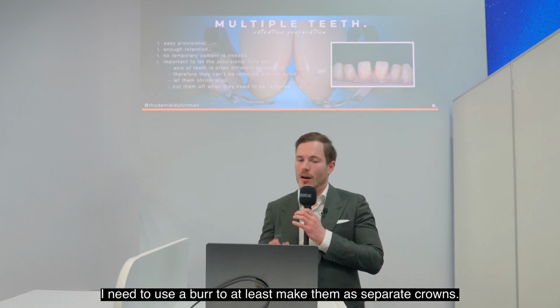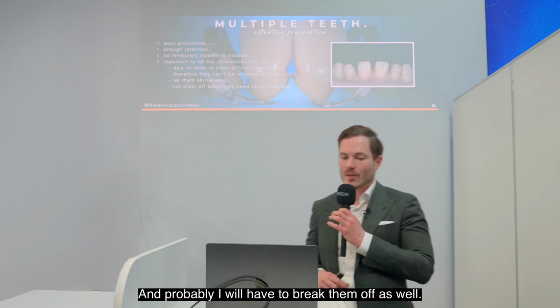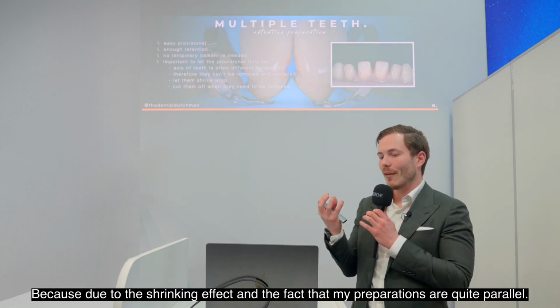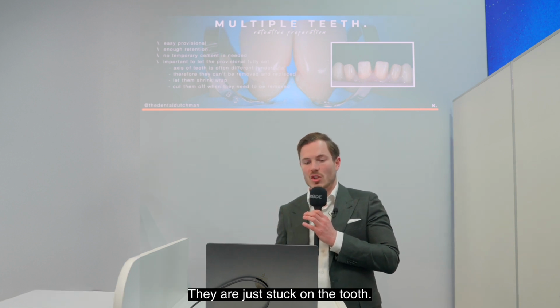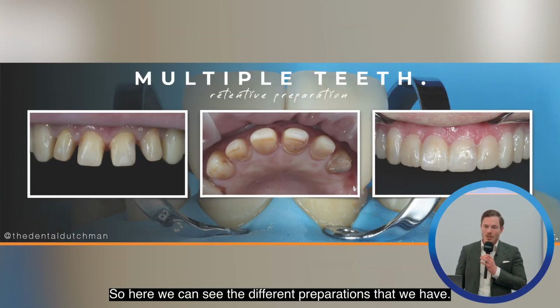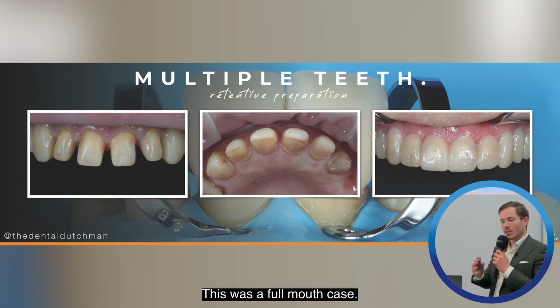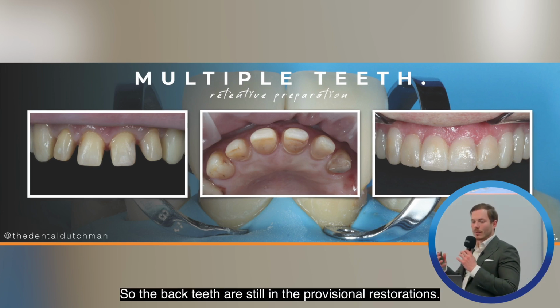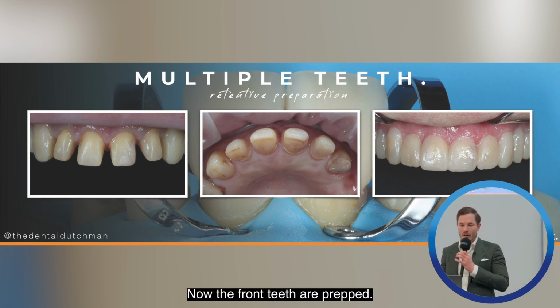I need to use a burr to at least make them as separate crowns, and probably I will have to break them up as well, because due to the shrinking effect and the fact that my preparations are quite parallel, they're just stuck on the tooth. So here we can see the different preparations that we have. This was a full mouth case, so the back teeth are still in the provisional restorations. Now the front teeth are prepped.